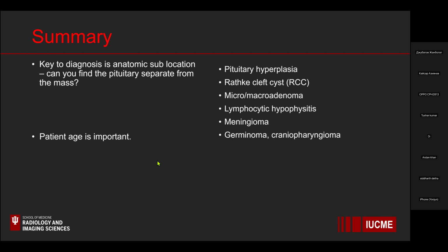Patient's age is also important. We talked about germinomas being present in the first decade. We talked about craniopharyngiomas having bimodal presentations, first in the first decade, and then in the 5th through 7th decade. So it's important to keep the patient's age in mind as well when you look at these cases.